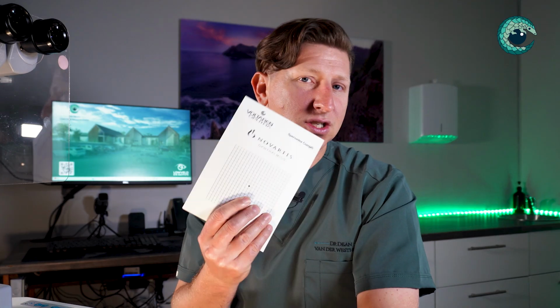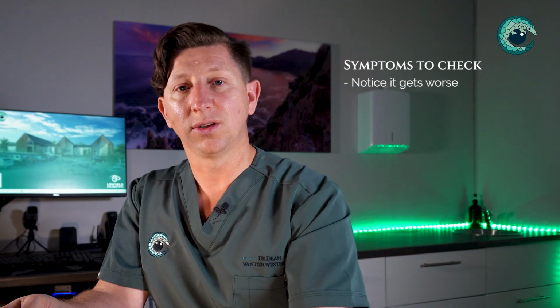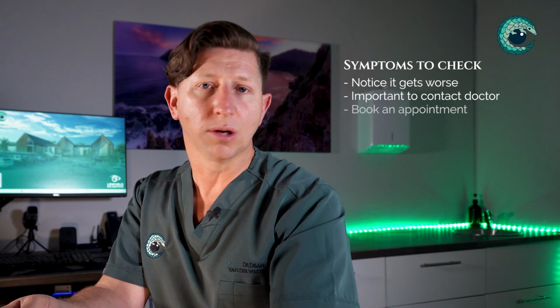So the Amsler grid really is just a screening tool to put on your fridge, to put on the mirror at home, and to remind you to close one eye and then the other and spend a few seconds looking at it. Now initially, if you have AMD, there may be distortion already. When you look at it, you may already notice some distortion. It's important to realize that that's your baseline, or the current distortion, and that may not get better. It may change over time. But if you notice it get worse, then it's important to contact your eye doctor and book an appointment so that they can have a good look at you again.